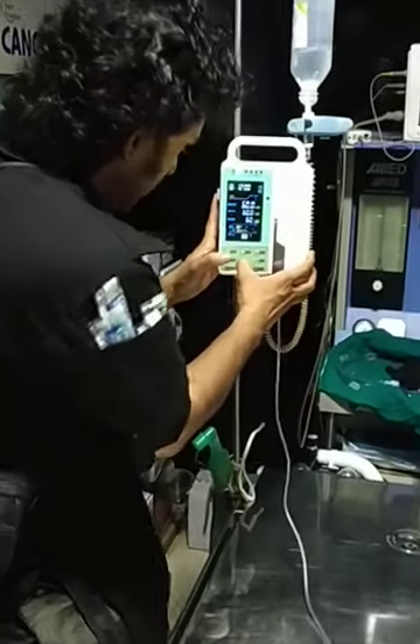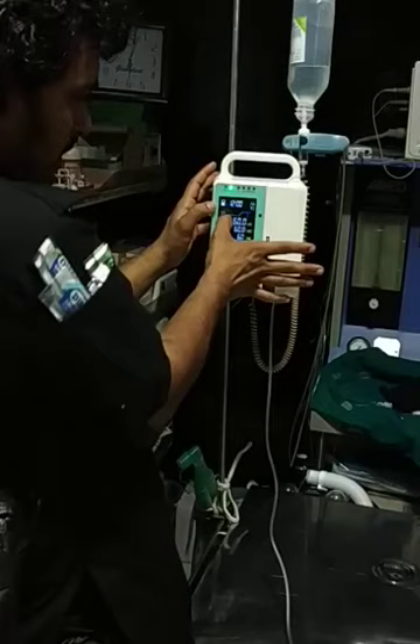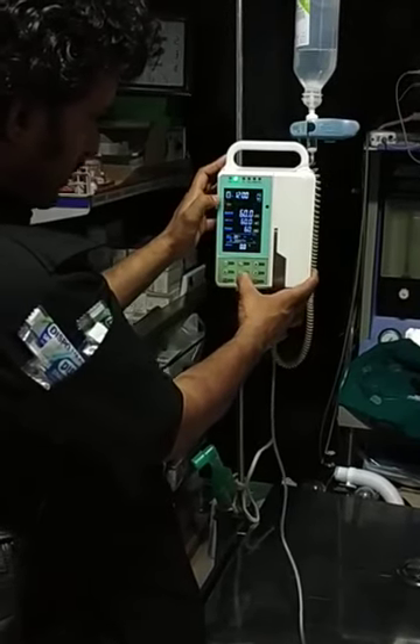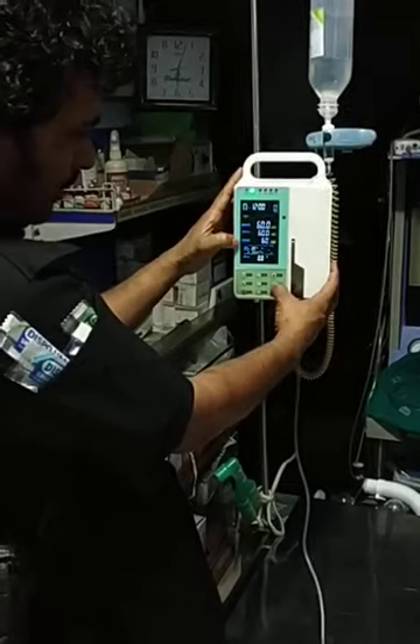Now if you see there is a setting over here. In the setting there are different modes. This is charging at the moment, this is the time, and there is the option of start, stop, and setting. In the settings, in the modes I have three options: one is with the rate, target volume, and time.